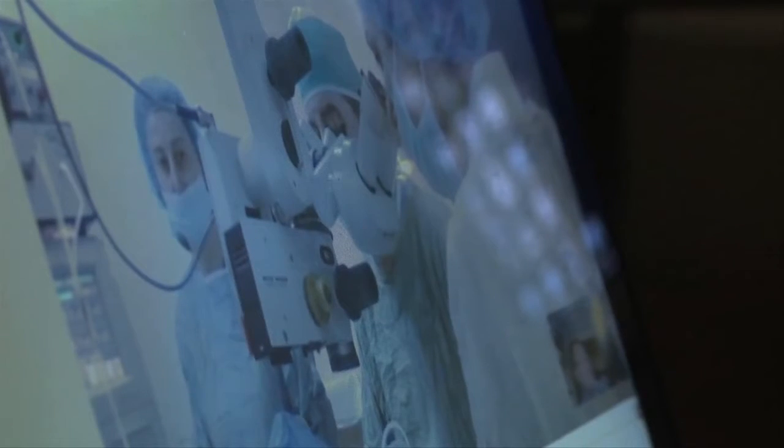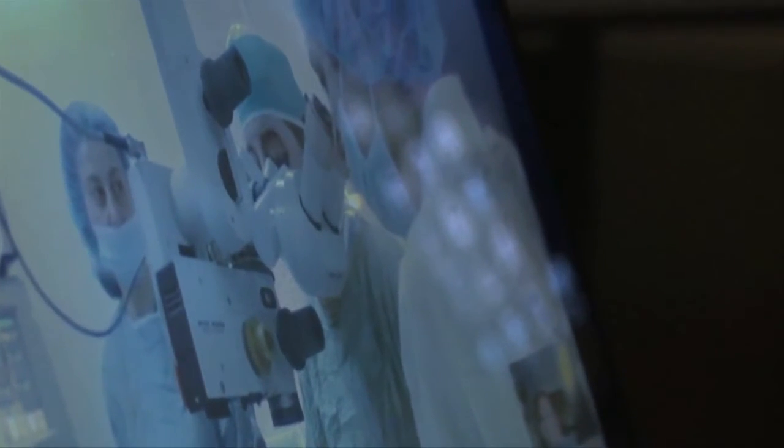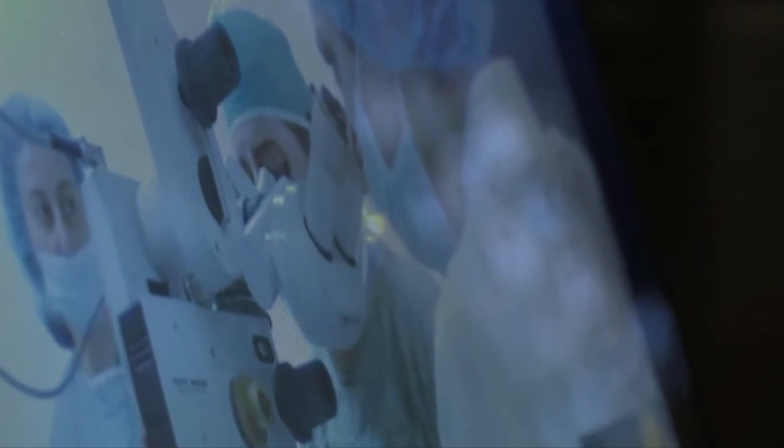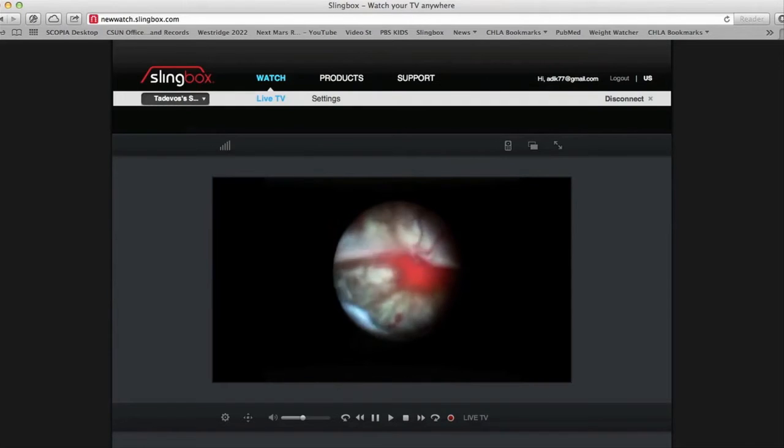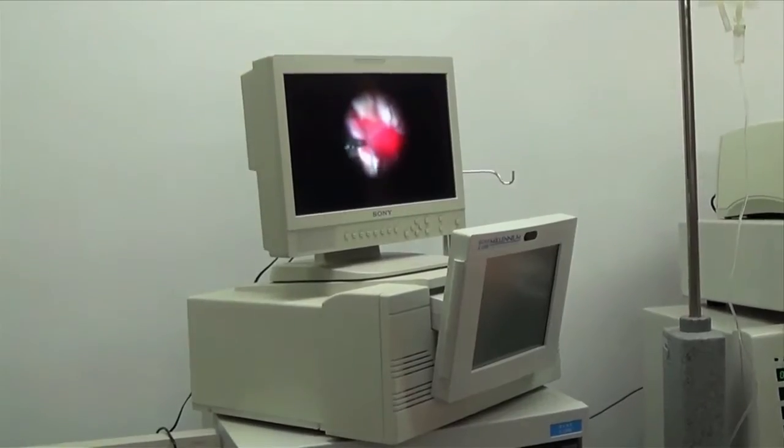The patient has very advanced disease. I've never seen diabetic retinopathy that advanced. There's a lot of fibrous membrane and tissue that they need to take off in order to get the retina to reattach — remove the scar tissue so they can actually flatten the retina. Once the retina's flattened and attached, it can start to work again.